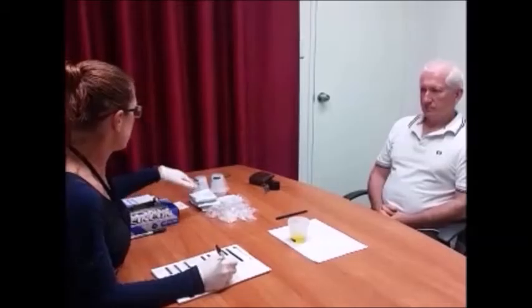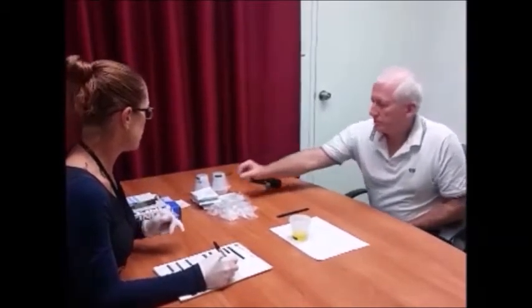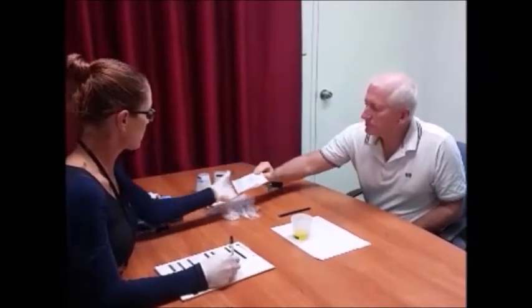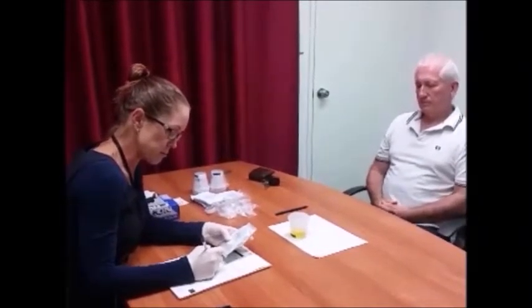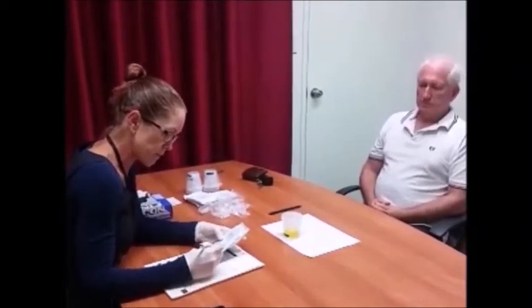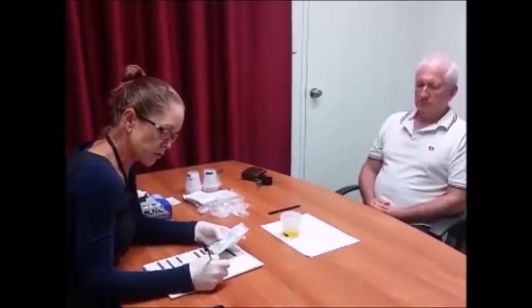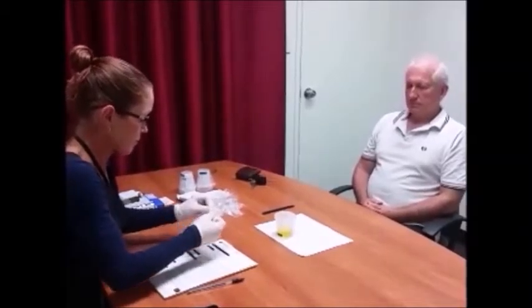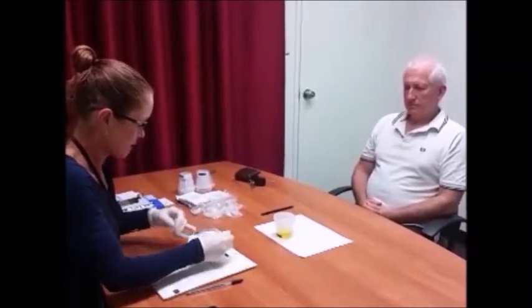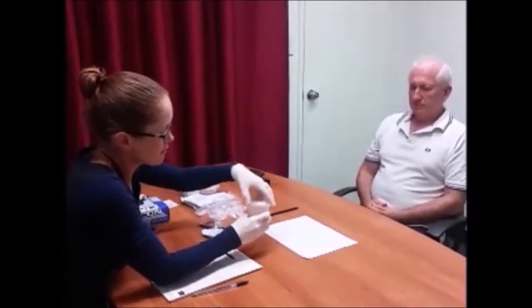Okay, Michael, I'll get you to please choose one of the testing lids. Pass it to me, thank you. I'm going to document the device name. So today we're using the microscreen, the lot number, and we're going to document the expiry date. Okay. I'll explain this as we go, Michael. Pop the cup up on its side so both you and the donor can see.